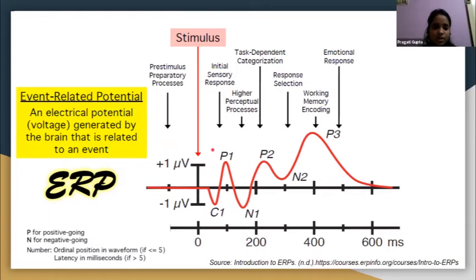And also we have the pre-stimulus activity, like the pre-baseline measures, which is very important, we'll see. Here the preparatory processes can be seen, like before the stimulus comes, what is the specific cognitive function? What does that mean? We can also look through ERP.